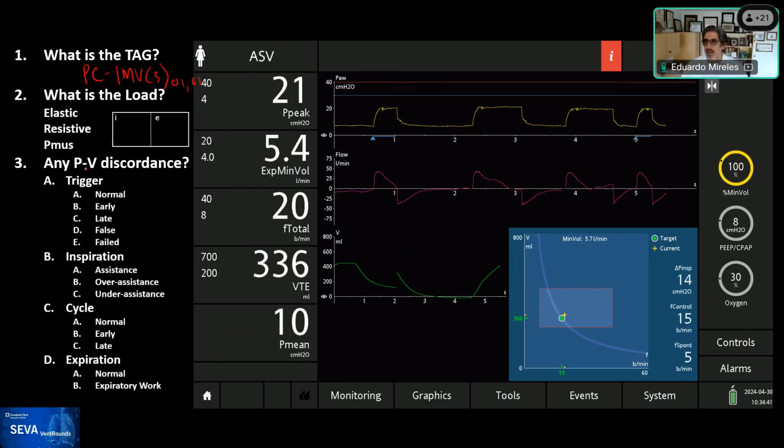She was sleeping, and we woke her up. So now you see these interactions with the ventilator. And I put a screen that we're going to talk a little bit more about in a second, but I thought that it would be important to show you that screen because it exemplifies the example that Rob was talking about. But what do you think now about the load?